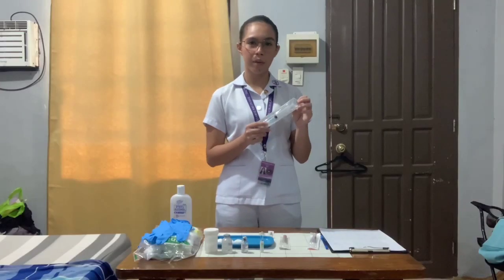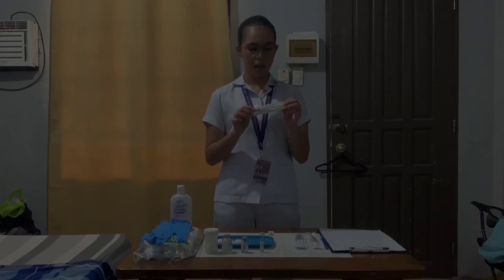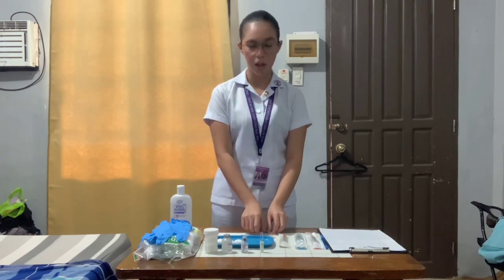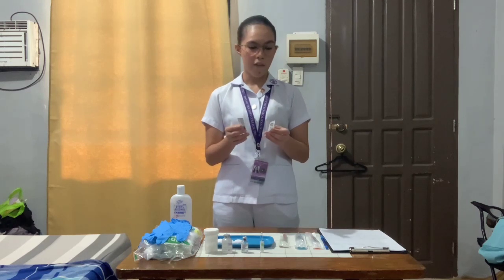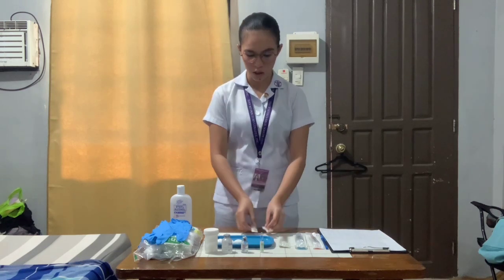And I also have here my 5cc for the intramuscular route, and my insulin syringe for the subcutaneous route. And then I have here the two filter needles or aspirating needles for me to use later on when I withdraw the medication into the syringes.